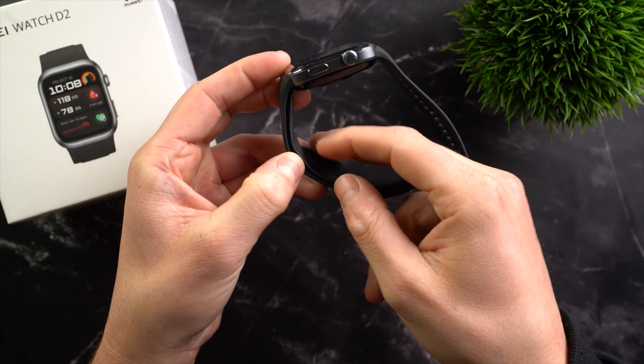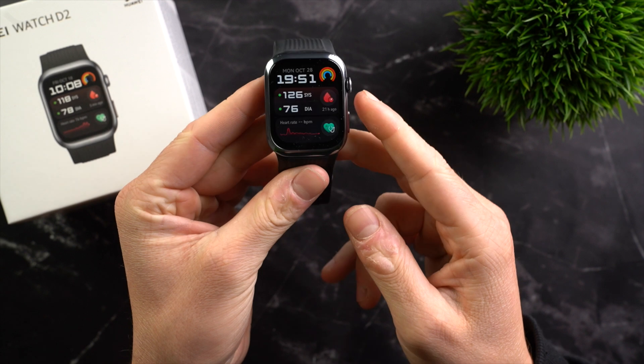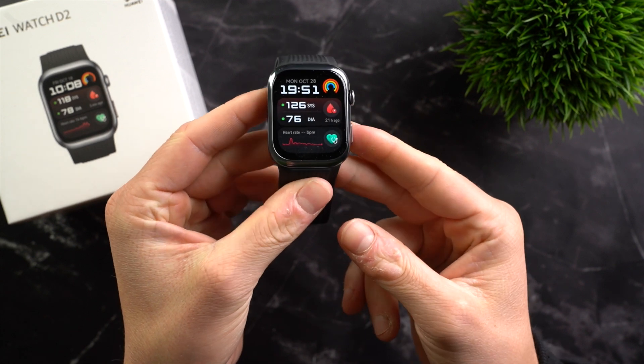When we start the blood pressure measurement, the cuff inflates until blood flow is briefly interrupted and then the air is released, just like a traditional blood pressure cuff. This measurement is not uncomfortable — you definitely feel the air cushion inflating, but it's not unpleasant.